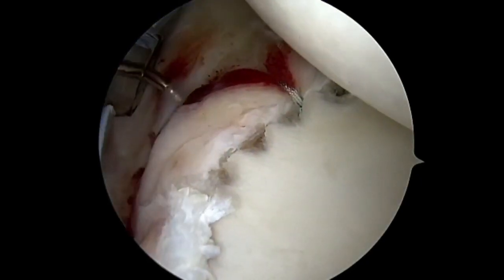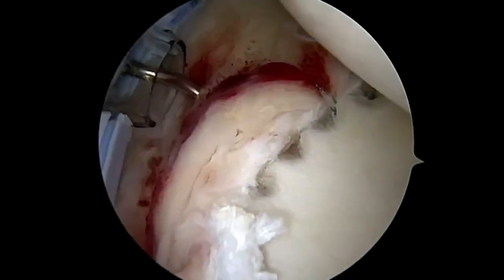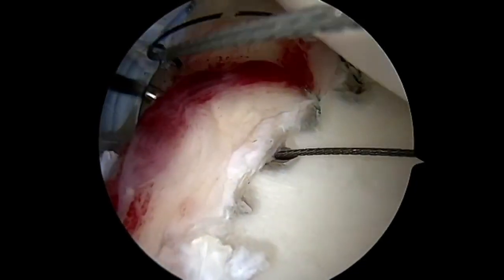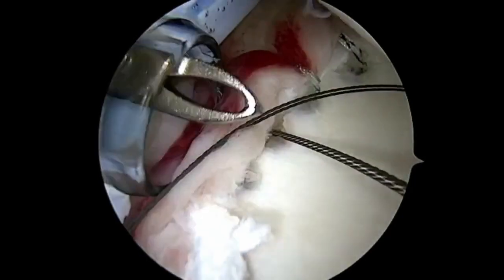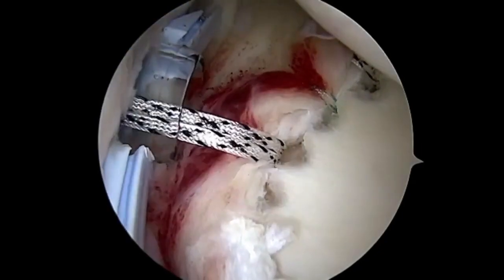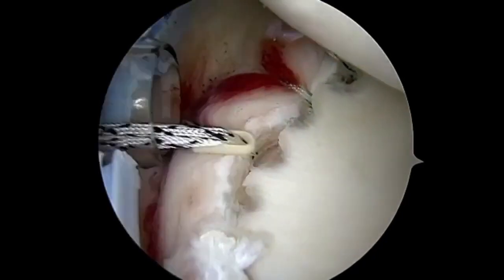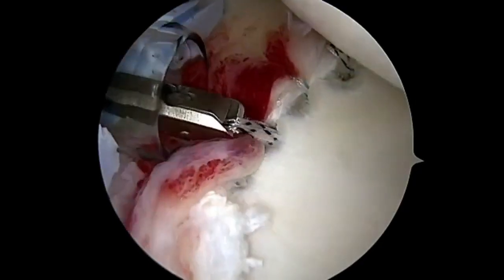When we grab capsule, we try to grab a little bit inferior to our drill hole and shift superiorly to decrease inferior capsule volume and ensure success of the procedure. Our two-portal technique does not create twists or loops in the suture as long as this technique is followed.